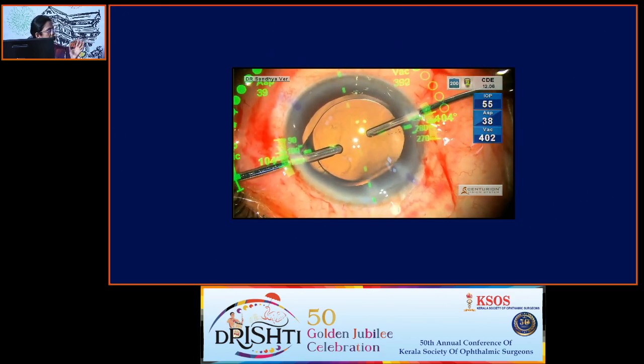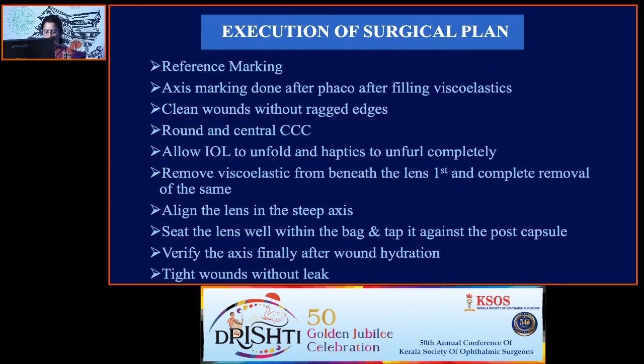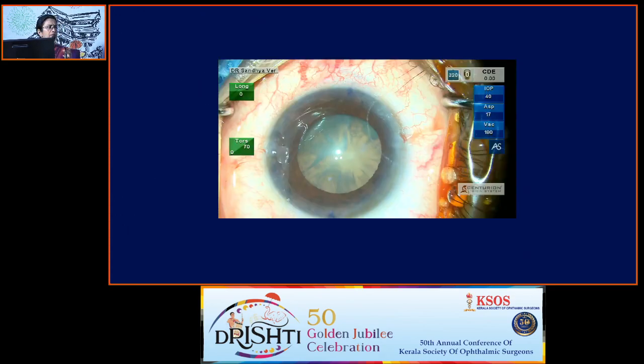So here the only advantage is that you don't have to consider the fading of the dye or the smudging of the dye spread and all, but it's a machine-dependent thing. So you can't depend on the machine 100% always. And sometimes we have to customize the IOL.